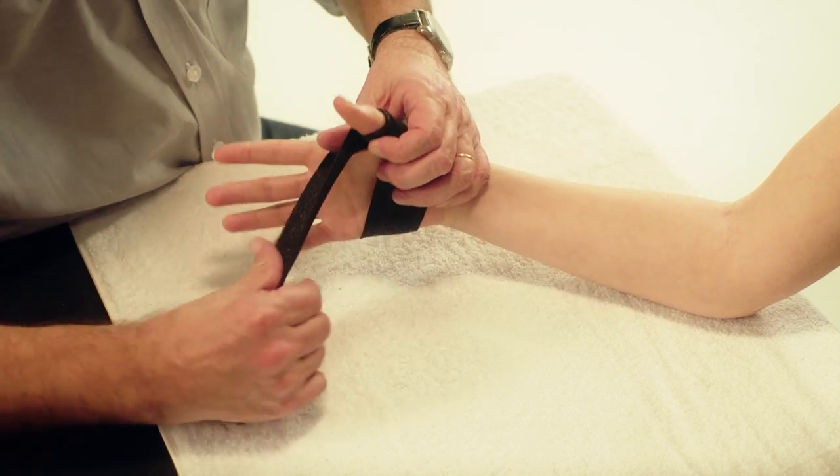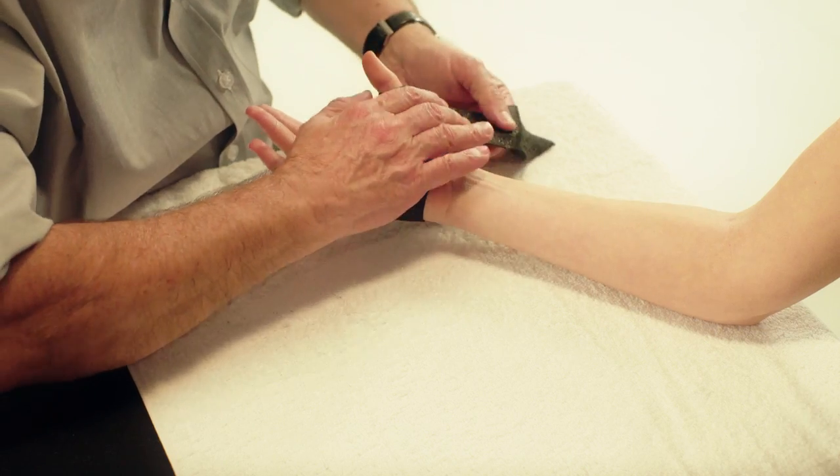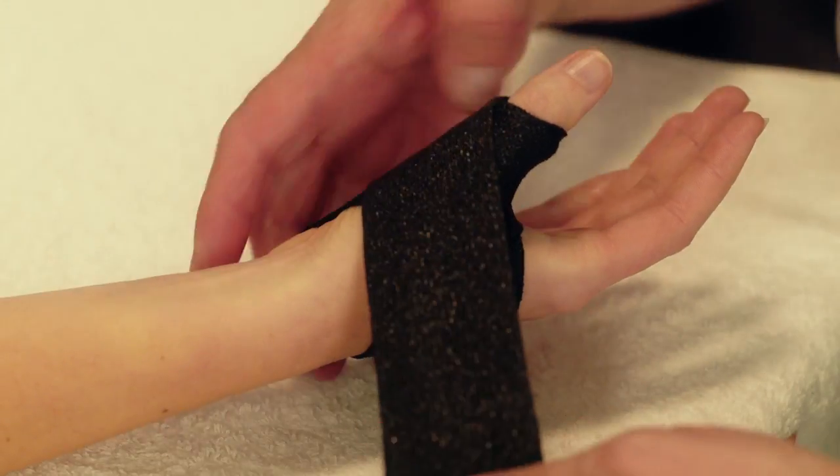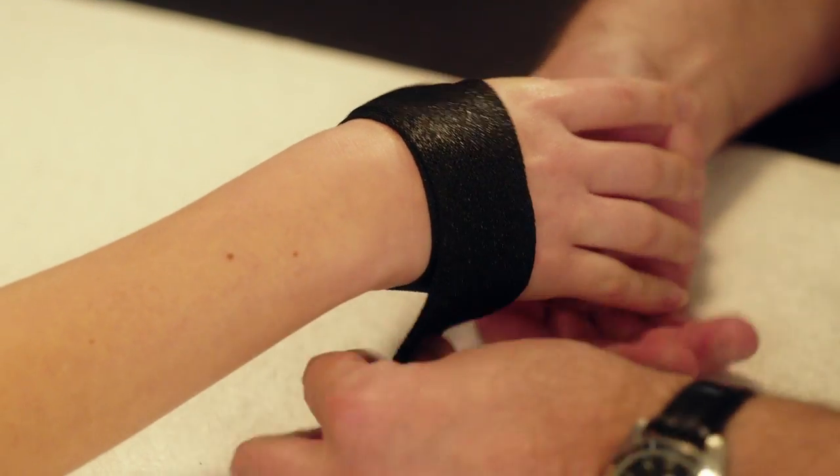Carefully pull the Orphicast over and through the first web space, stretching it while avoiding folds and wrinkles. Continue the path to cover the thenar eminence and continue to the dorsal part of the hand.